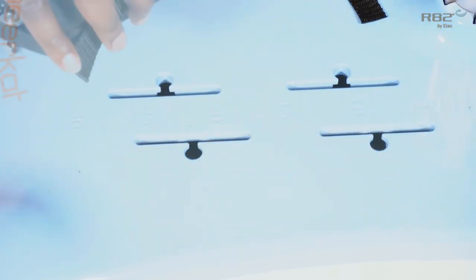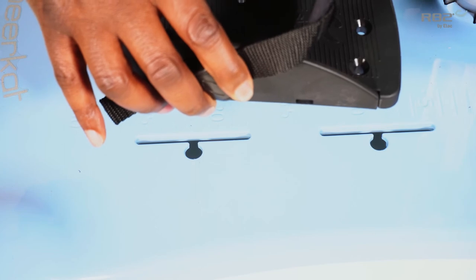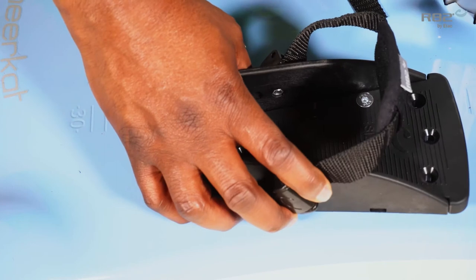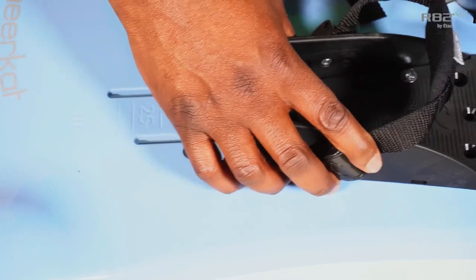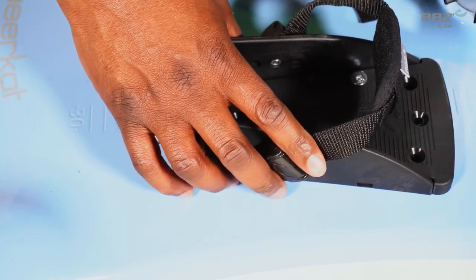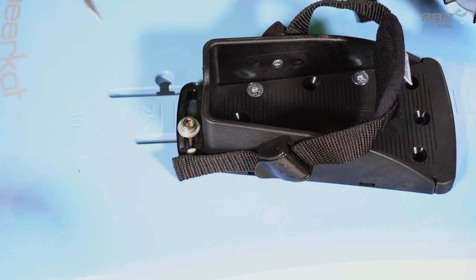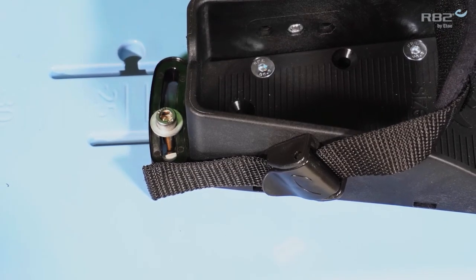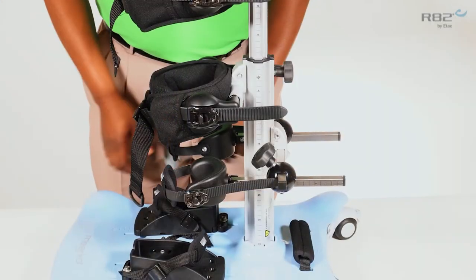Reverse the footplate and reinsert it into the track. Remember to tighten your sandal once it's in your desired position.